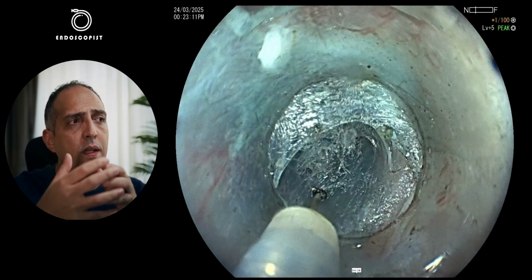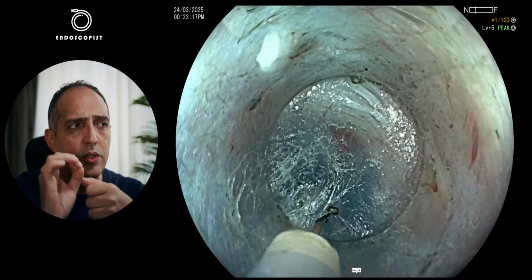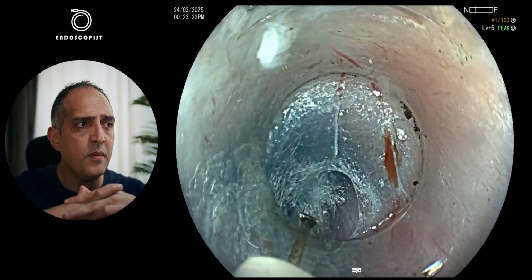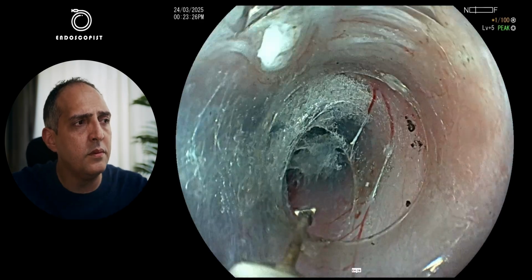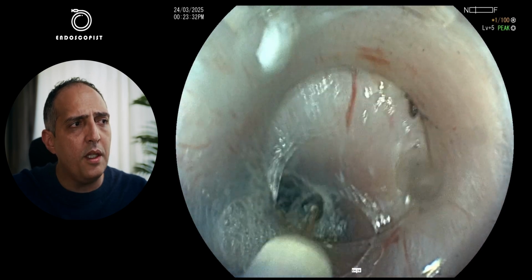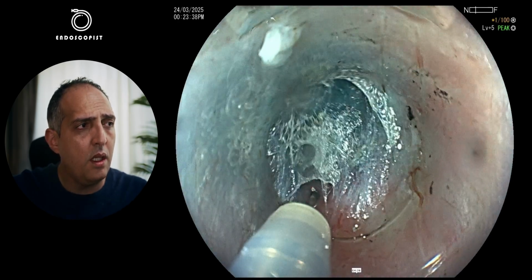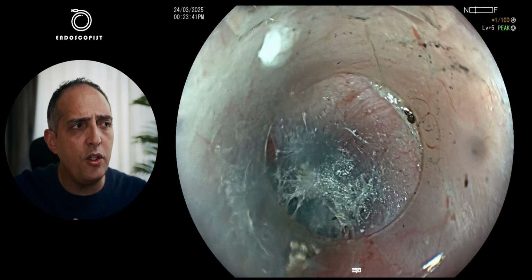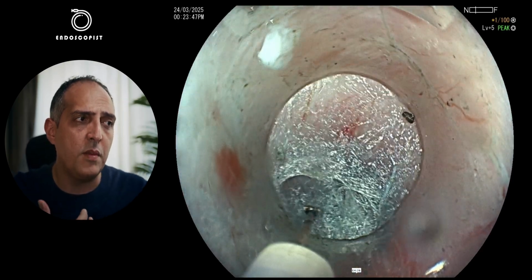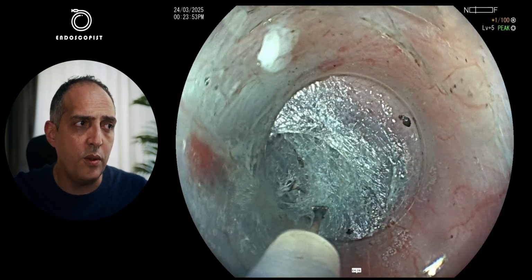At some points, I will feel I'm struggling with the tunnel because it's too small, so I will withdraw my scope a little bit, and I will just do some trimming at the edges, which will open the tunnel again for me, and I can pass further. Whenever you are approaching the cardia, you will start to feel that the space is becoming tighter. And here it is very beneficial to use mechanical traction, because for me, mechanical traction is much less hazardous than the electricity or the current. But of course, you have to do it very gently.